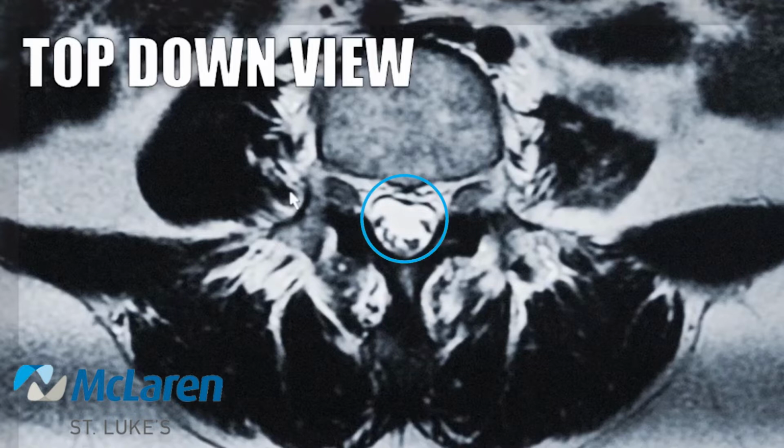This oval white structure is the spinal canal itself, filled with spinal fluid. And then there's an area where the nerve goes out. So you can see this gray structure here is a nerve, and this gray structure here is a nerve. The nerve goes out through a space between the edge of the disc, which is this point right here. This dark line represents the edge of the disc, and this dark border right here is the edge of your joint. So between the edge of the disc and the edge of the joint, there's an opening or space where the nerve goes out. And at this level, you can see how nice and big and open these spaces are for the nerves to go out. So this would be a normal looking level of the lumbar spine.